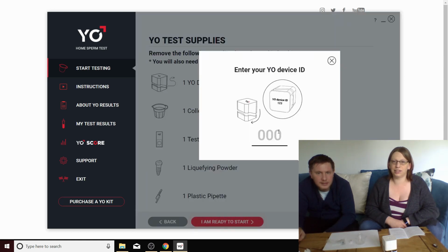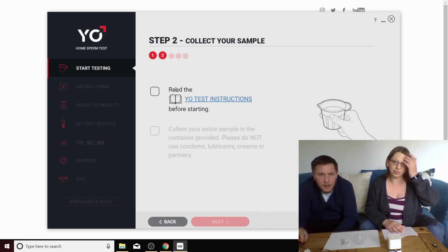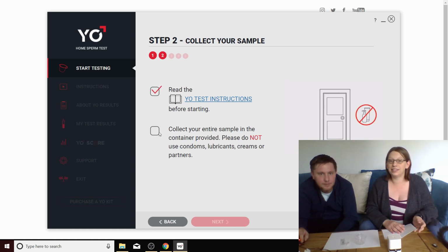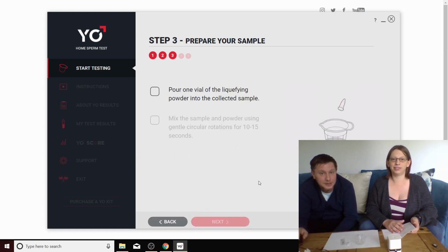Enter your Yo device ID. Done. Let's check that's all connected. Awesome. Brilliant. Read the... we have done that. In fact, we have them in front of us. Collect the sample and container provided. Do not use a condom, lubricants, cream, or partners. I did not do any of those things.